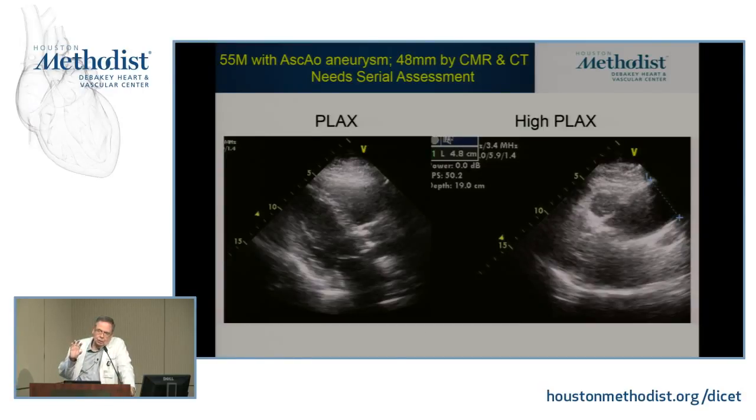So you can pick the patient, and in some situations, and I do it in my own practice, I use the serial yearly echo, and then I use the CT or the CMR, depending on which of the two I had started with, as a more periodic, a little bit more stretched, particularly in patients that appear to be very stable, that are not changing very rapidly.